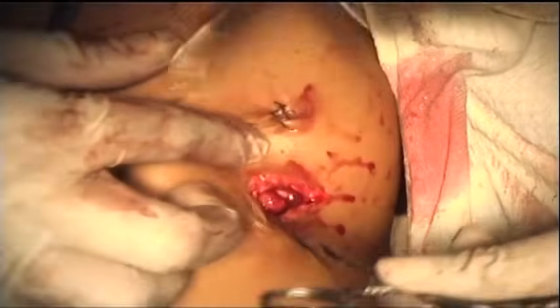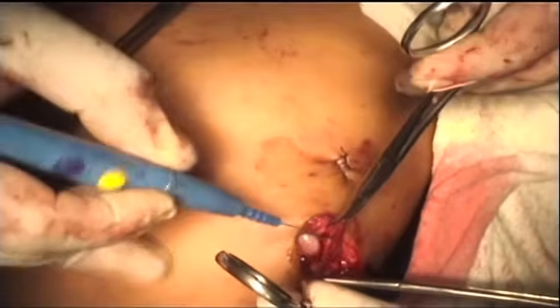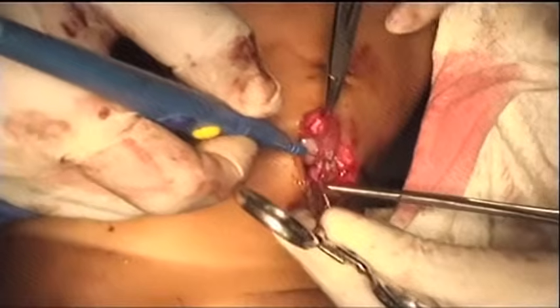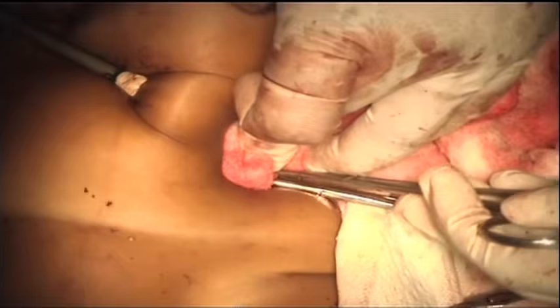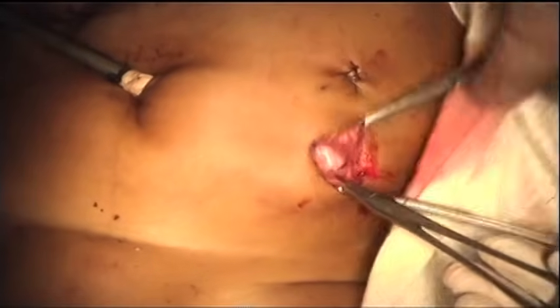Initially the opening was made a little too small, so it was suitably enlarged to deliver the colon and anchor the colostomy in place. It's not wise to try and drag the colon out through an opening which is too small, because we can do unnecessary damage to the colonic wall.